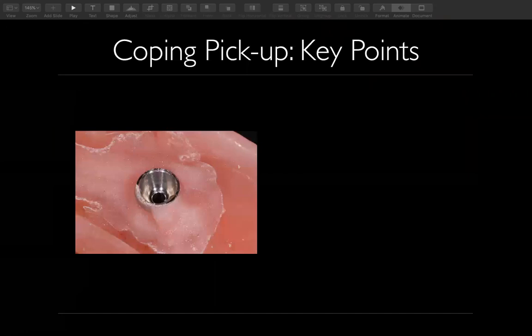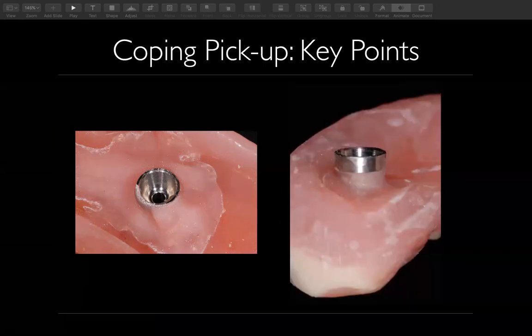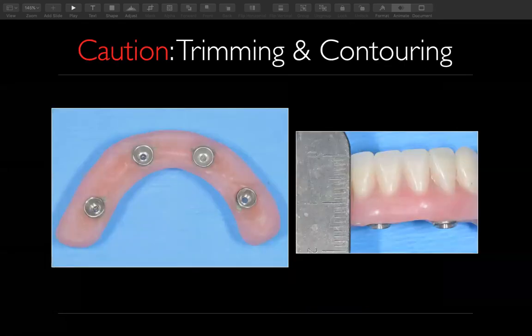When you're going to add your acrylic, you don't want to get it into the interface of your temporary coping. You want to keep it below the polished margin, and you want to backfill around. Like I said, we're not going to leave any sort of concavity. I want this appliance to be as convex, flat, and rounded as possible. You can see here, this has maybe a little bit longer cantilever extension than what I would typically do. But in this particular photo, it is what it is.